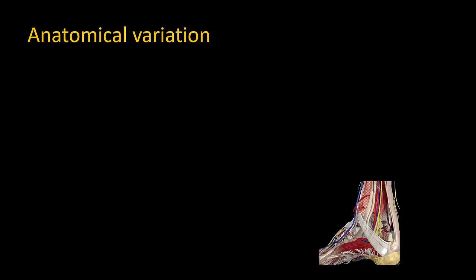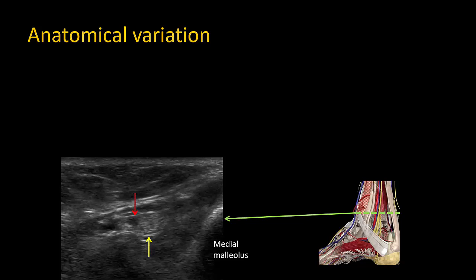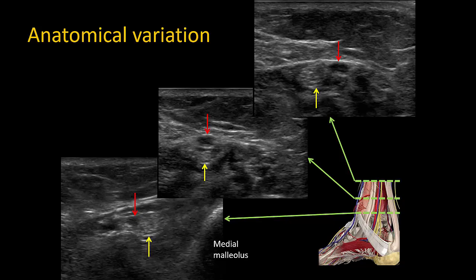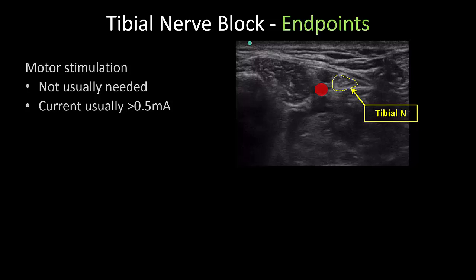Anatomical variation in the position of the tibial nerve is more common than you might think. In this picture the medial malleolus is on the right and we see that the tibial nerve is anterior to the artery instead of posterior. What usually happens is that as we trace the nerve proximally the relationship changes so that the nerve eventually comes to adopt its usual position posterior to the artery. The nerve's identity may be confirmed by neurostimulation; however, the current required to elicit toe flexion is usually more than half a milliamp and more often in excess of one milliamp.